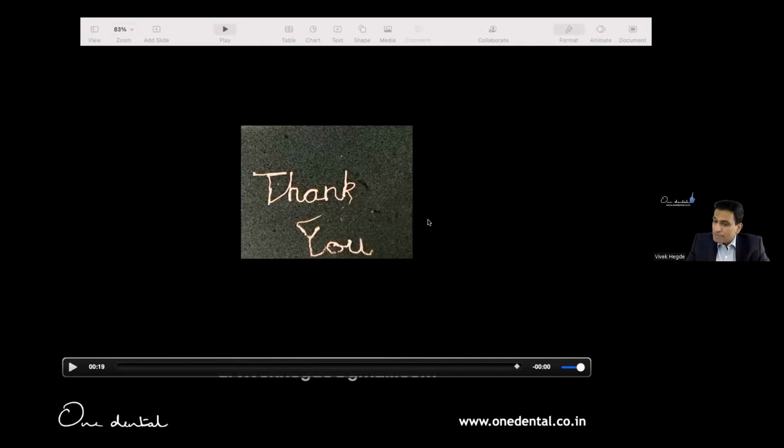Minimal preps are enough, they say, because we're talking of minimally invasive endodontics. But having said that, when you say minimally invasive endodontics, I want the preparation size to be 25 minimum. Taper, not 6, 7, 8 anymore. Taper should be just 4%, more than enough. So that's all I want you to do. Please try and use the preparation that much and keep it 20 to 25. Then even the laser will work.